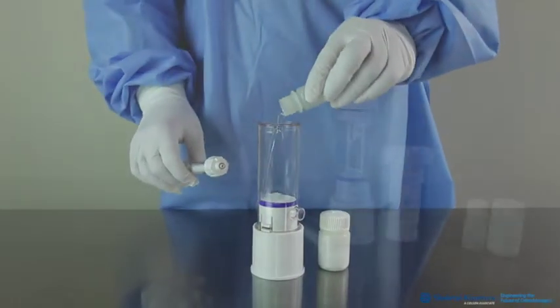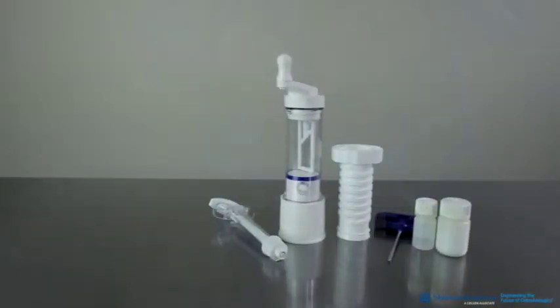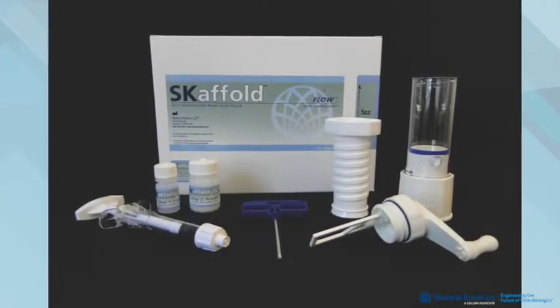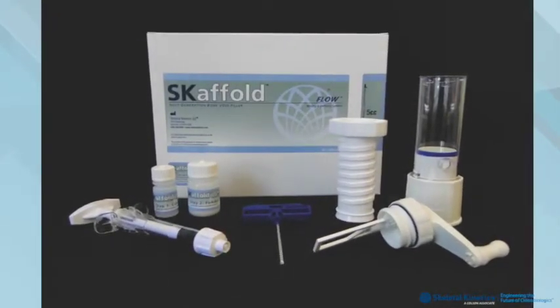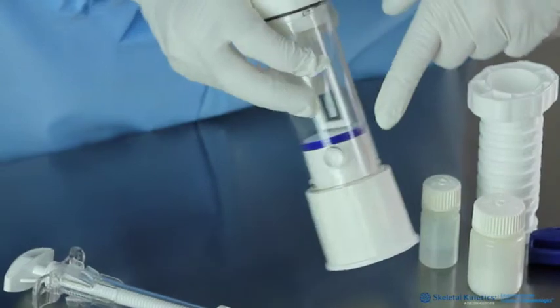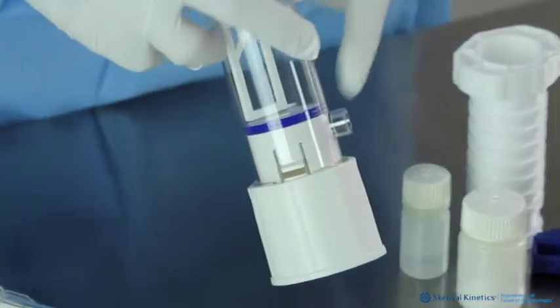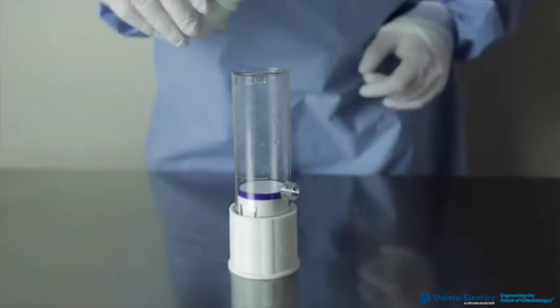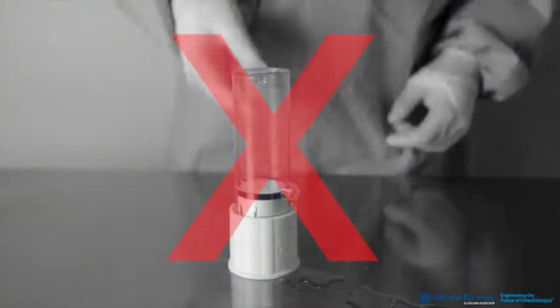Now that you have all the materials on the sterile field, you can begin the mixing process. It is critical to make sure the surgeon is ready to use the product, because once you start mixing, the time begins and there is no turning back. It is critical at this point to ensure that the bottom or base of the mixer is above the side port. If it is not, the liquid will pour right out and you will have to get a new kit.